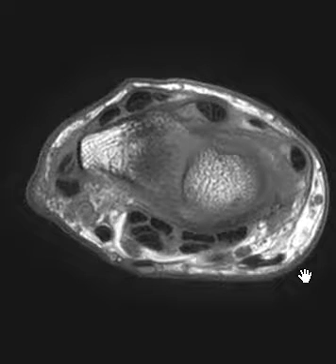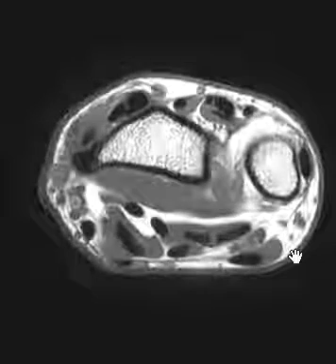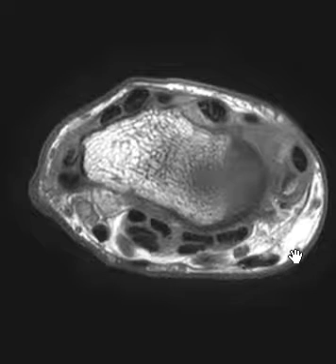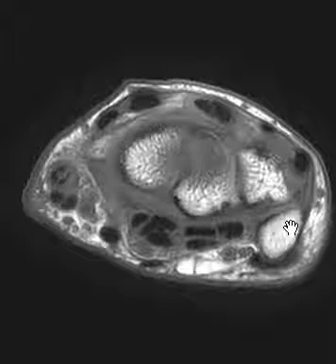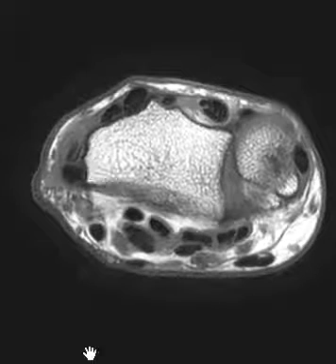Hello, this is Dr. Gay from First Look MRI, and this is a 51-year-old male with complaints of radial-sided wrist pain and swelling for about 6 months. They saw a hand surgeon and they thought clinically they had Quervain's Tenosynovitis, and so we look over here on the radial side of the wrist for findings.